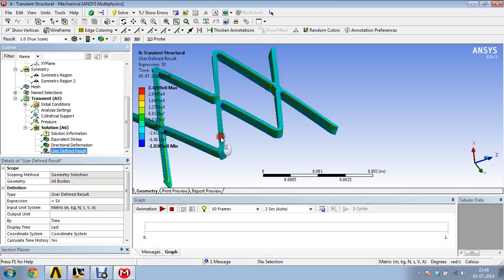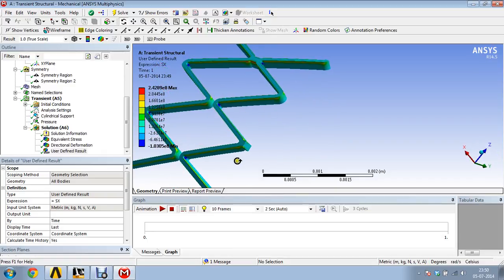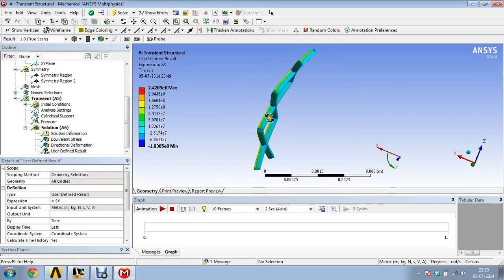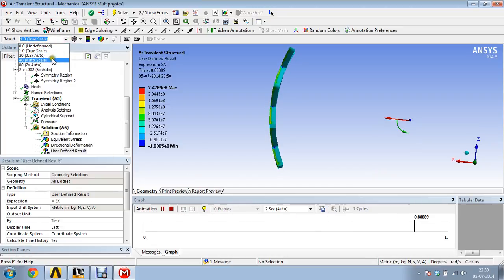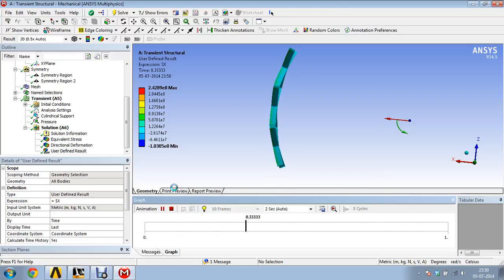So we can have user defined results, and we observe that they are in synchronization with what we expected. So we'll run the simulation and let us see what happens. In true scale we cannot observe any displacement because it is too small. So if we use auto scale, we should be able to see some kind of deformed structure. We'll go into this one, and I think we should be able to see some displacement here. See, you can see some displacement here.